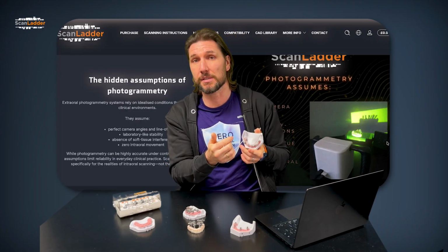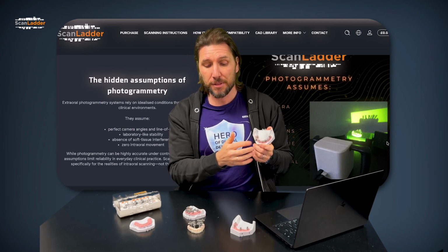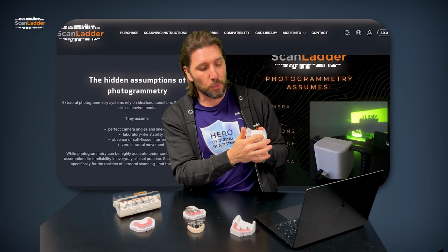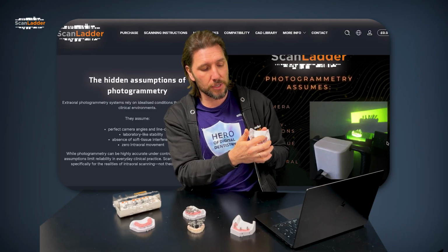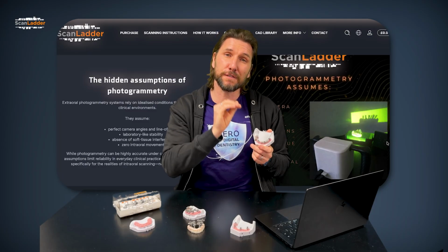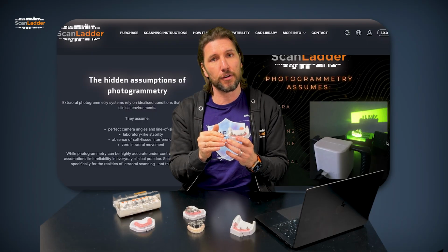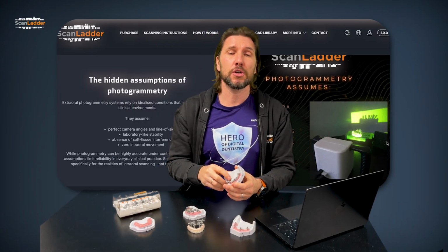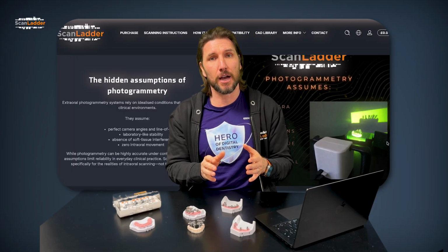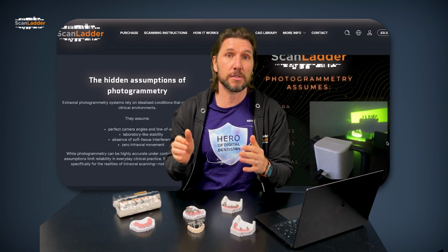So these scan bodies you can see positioned here, these are entirely covering that soft tissue. Now you might be thinking, in that situation, how do we match the data? Well, we'll come to that. But with this, we've covered all of that soft tissue, the scan bodies run all the way around that arch. So as the scanner is there, those features, the geometry of the scan bodies, allow each and every frame to match together perfectly, so that overall we end up achieving a really accurate result that can still provide when we can't use central location scan bodies.